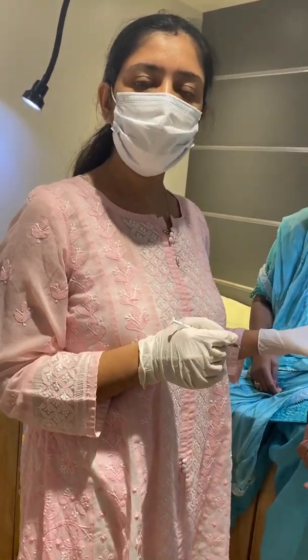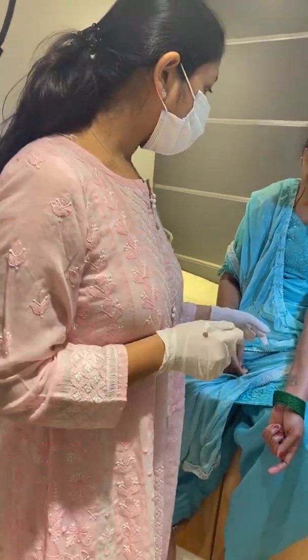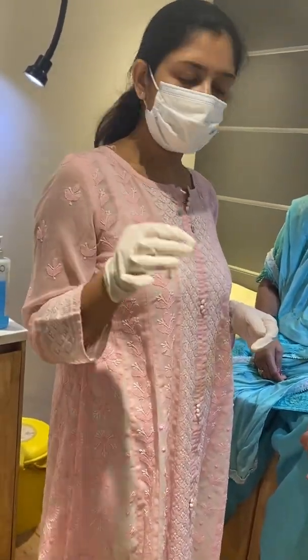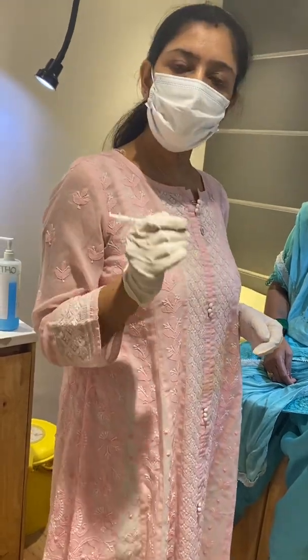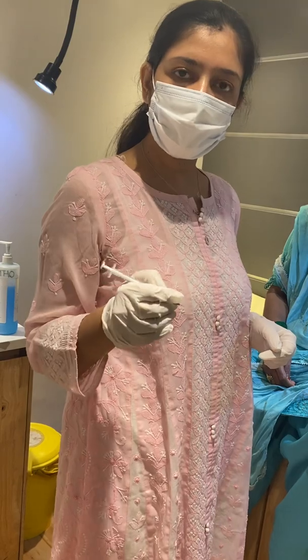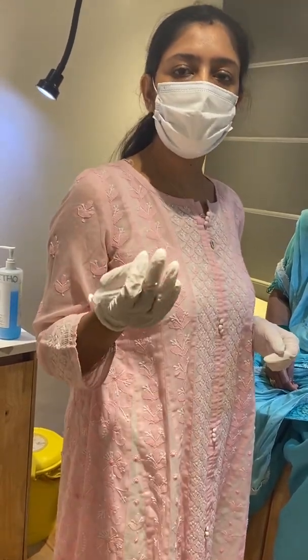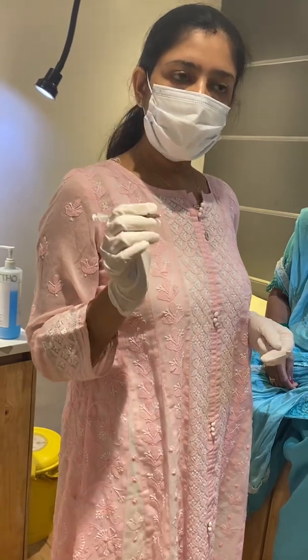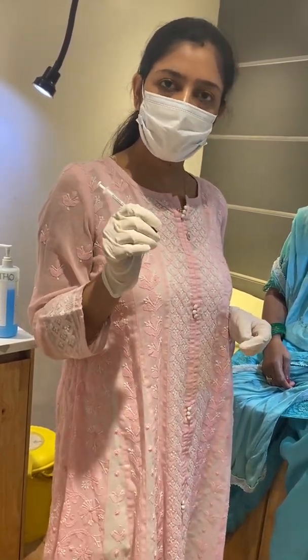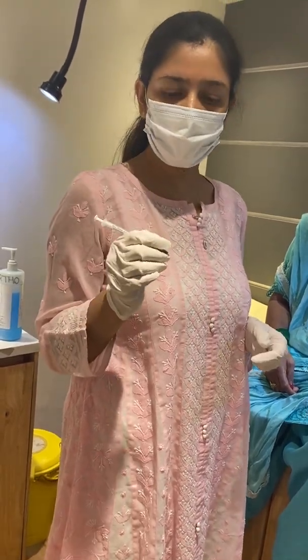First we will demonstrate how to do the pathergy test in the skin. We have to take a clean sterile needle — I have taken a 1 ml syringe — and with the help of the needle we are going to make multiple pricks, around 4 to 5, in a linear fashion. Mark the boundary of the pricks and then read the results after 48 hours. Make sure that the needle goes at least 3 to 5 mm into the skin, because we have to reach the dermis to elicit a response.